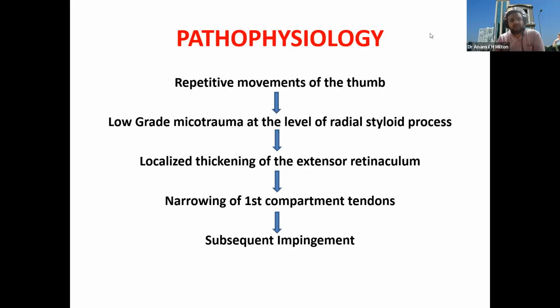From the Lister's tubercle, if we go to the radial side, that is the second and then the first compartment, and when we go to the ulnar side, it is the third compartment. So the Lister's tubercle is the demarcation between the second and third compartments, but de Quervain's is the pathology of the first compartment. So when we put our ultrasound probe over the dorsal part of the radius, we can find the Lister's tubercle, then the second compartment, after that the first compartment.